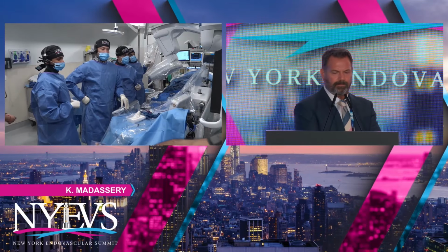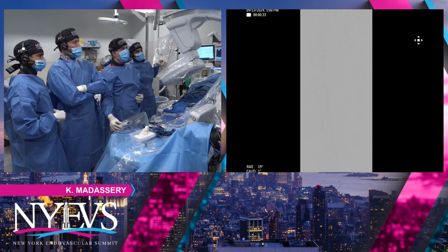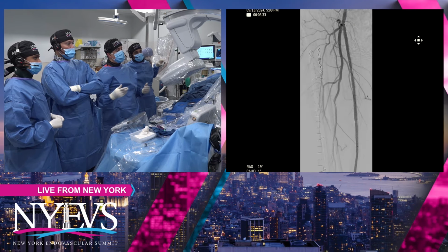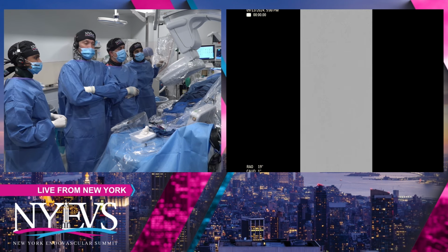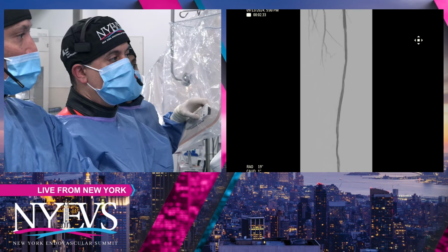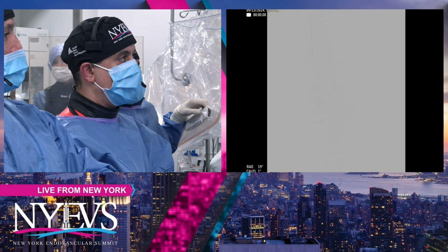All right, Vishal, what does the final picture look like? Pictures after our DCB at the distal end and two stents proximally and distally. Let me show you the shot. This is our picture from proximal to distal. That's the stent placed right there, beautifully placed right at the ostium by Karthik and Raman. You can see very good blood flow going down. The expansion of the stents is right up there.